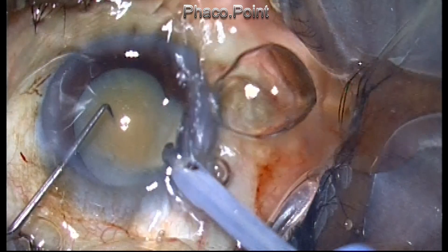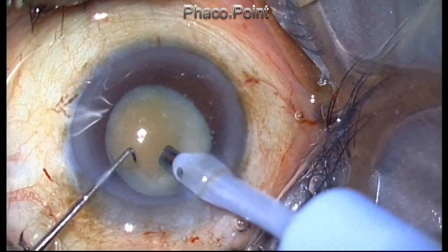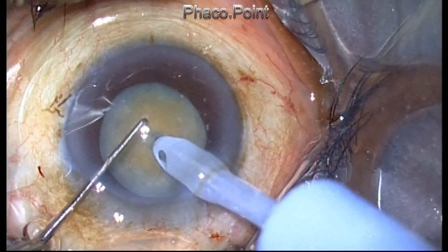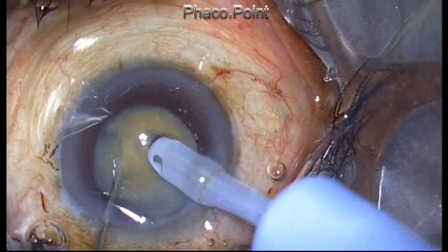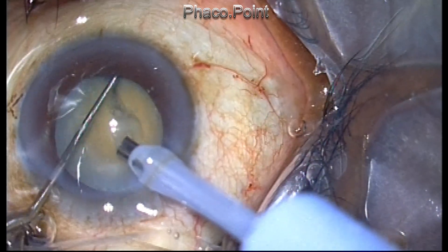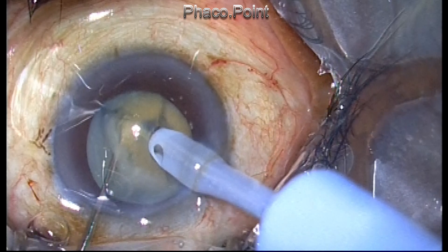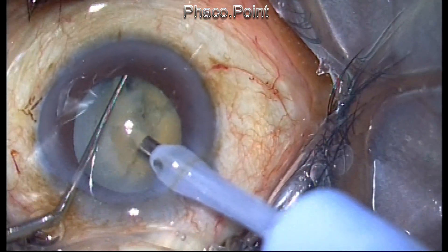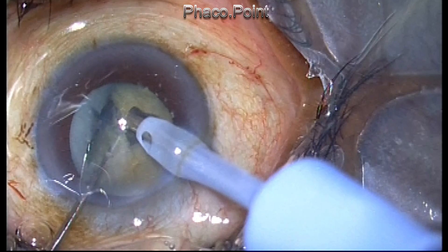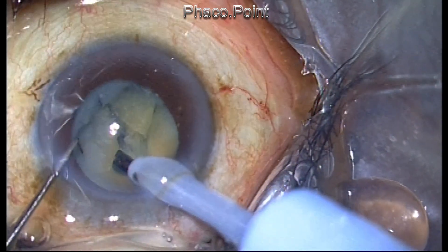Moving on to phacoemulsification: 1.5 millimeters of the phaco tip is exposed with a power setting of 40 percent, driving the tip inside the nucleus. The chop is quite easy because the nucleus, even though it looks hard, is actually chalky. With the right settings — a vacuum of about 350 millimeters of mercury, power setting of 40, and micropulse mode — it is very easy to hold and chop this nucleus.